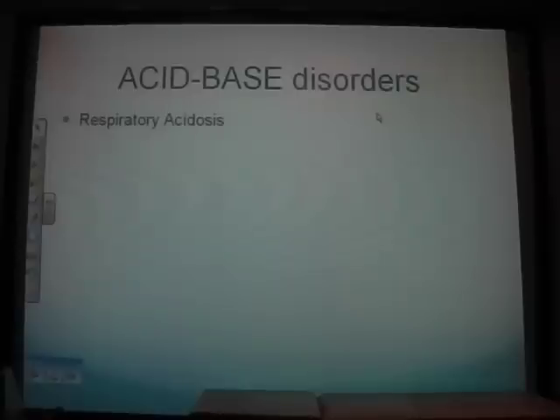Go. Anything? Type 2 respiratory failure. So what is type 2 respiratory failure? If you just retain carbon dioxide, is that type 2 respiratory failure? Yeah. So you have to have hypoxia as well as hypercapnia. You have to have both to have type 2 respiratory failure. But that's a secondary component, isn't it? Something is driving the type 2 respiratory failure. So what would be driving it? Alveolar hypoventilation. Respiratory depression. COPD. Okay, simple as that.